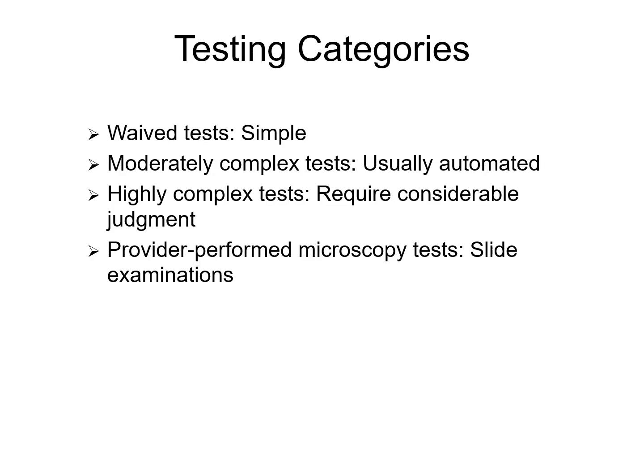There are different test complexity classifications. The first one is your waived test. Its characteristic is that it is simple and a low risk test. An example of this in the serology lab would be a basic rapid assay. The requirements for this type of testing are minimal training, and it usually does not require formal laboratory certification.